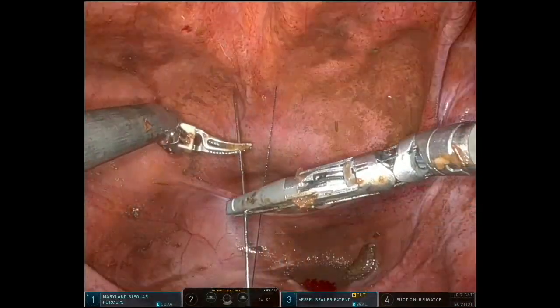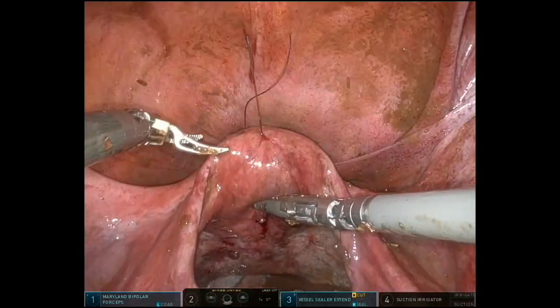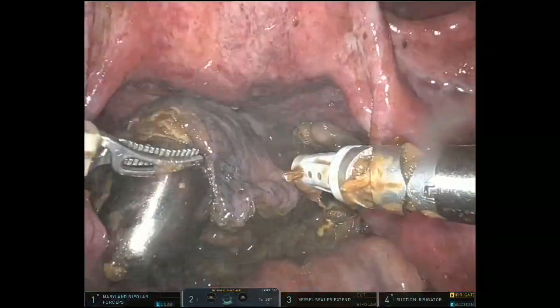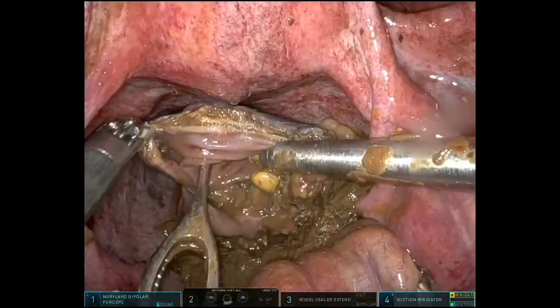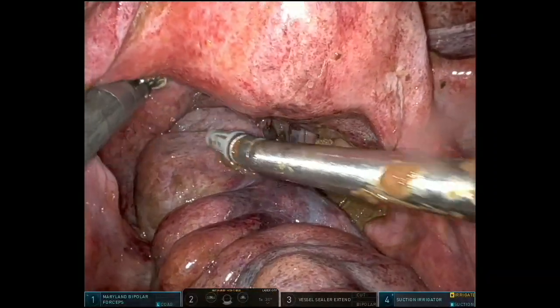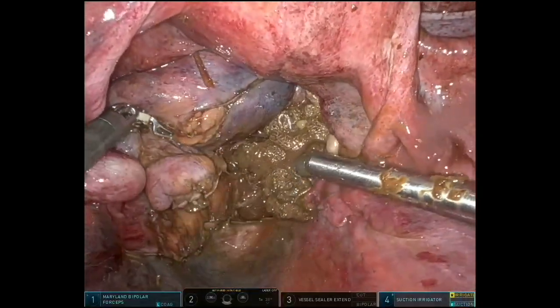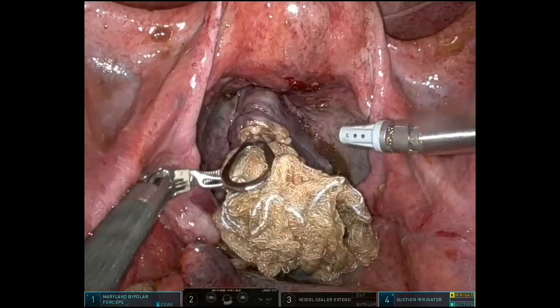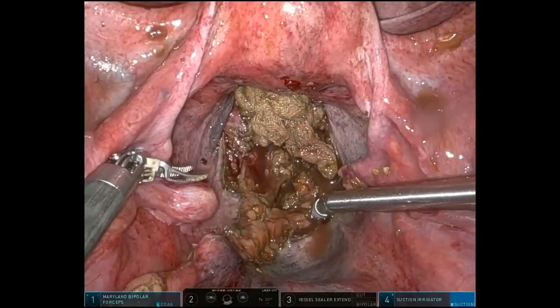This is the uterus being retracted for better exposure, followed by using the dilators and ring forceps to get the specimen extracted via a natural orifice approach. We removed all other sponges as well.